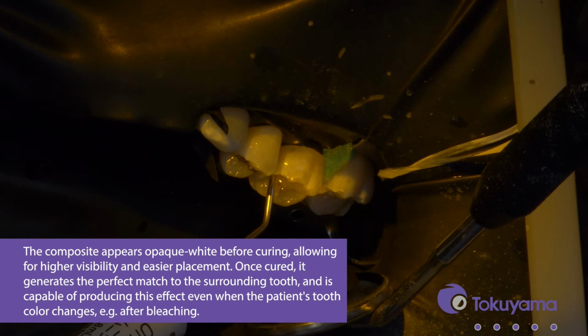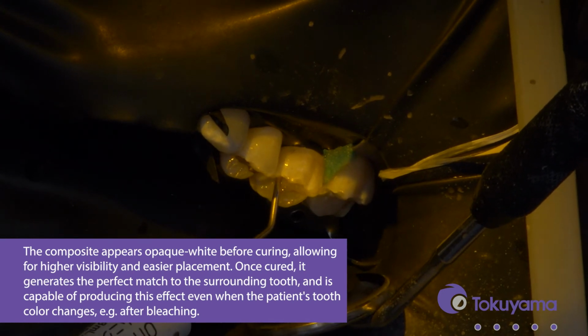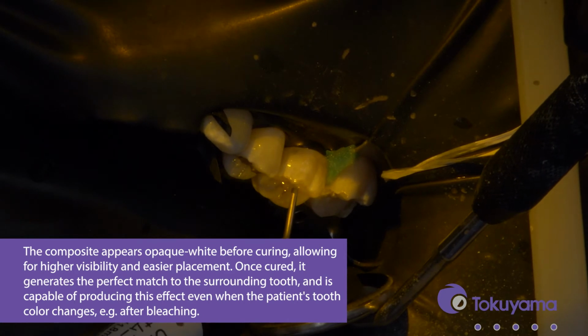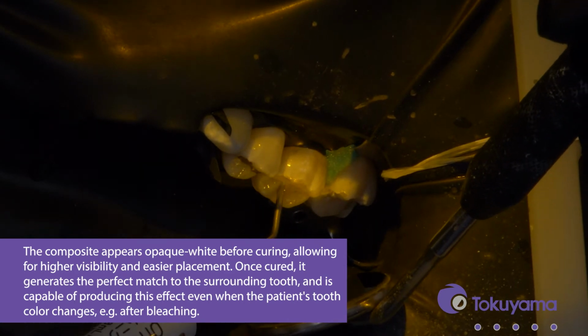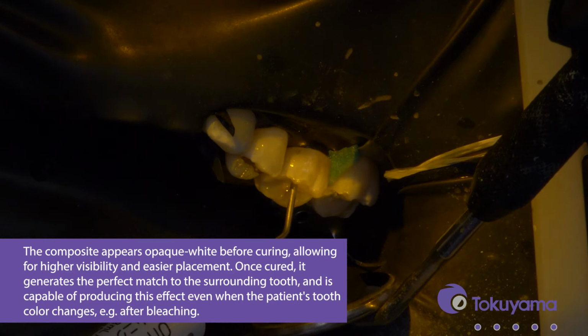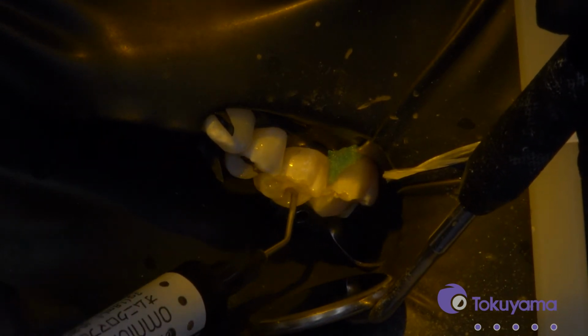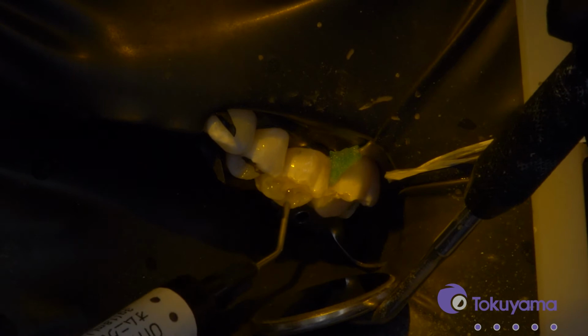Now, as I mentioned, as you extrude this material into the tooth, the material looks very white, which is very helpful, especially wearing loops and having my orange filter. It's great to be able to see the restorative material. And so I have about a millimeter, millimeter and a half to fill here. So we can do this incrementally. So I'm going to do part of the prep. Go ahead and cure.